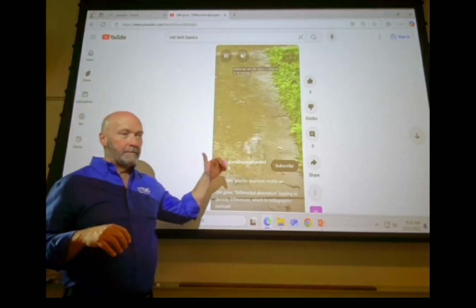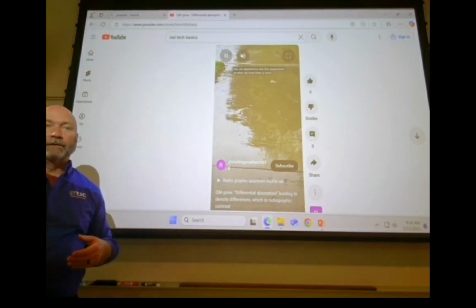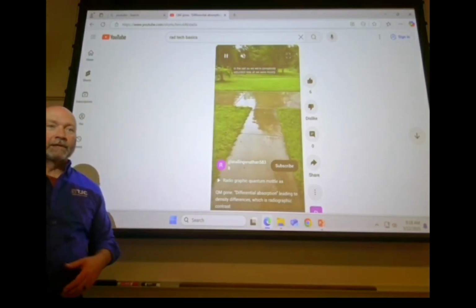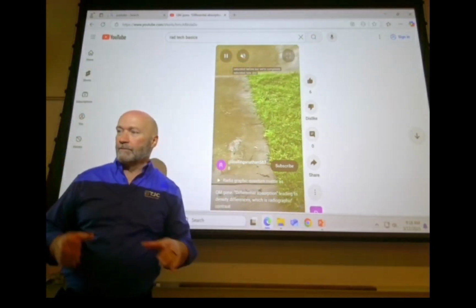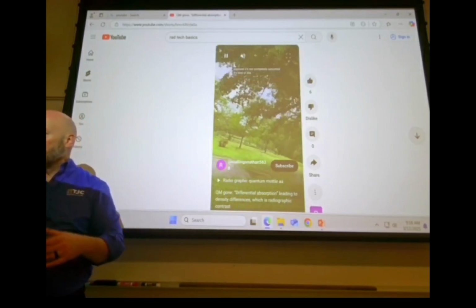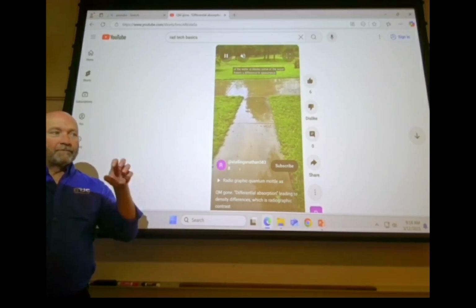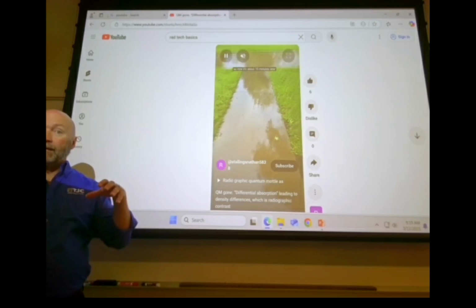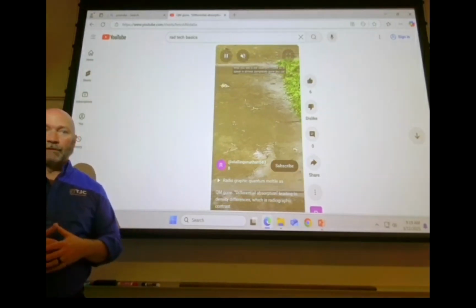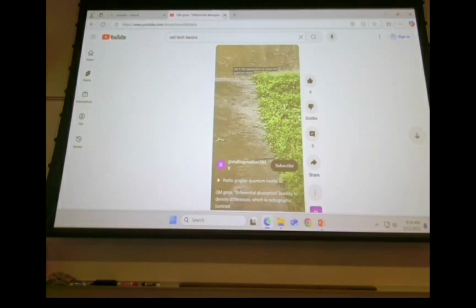So generally speaking, in a reasonable exposure range, you're not going to have a problem with contrast in the digital world. It's not until you really mess something up. You shoot a hand with 500 mAs. Regardless of what your kVp is, you hit a hand with 500 mAs, and you can kind of think of your individual detectors as like individual cups of water, right? If you take a super soaker or water hose and you just start spraying them, then you're going to have different levels of water in each one of those cups, right? But if you spray them long enough, what's going to happen to the cups? All of them completely full. You can't differentiate between them, right? So that is a way that you can lose contrast in a digital world.